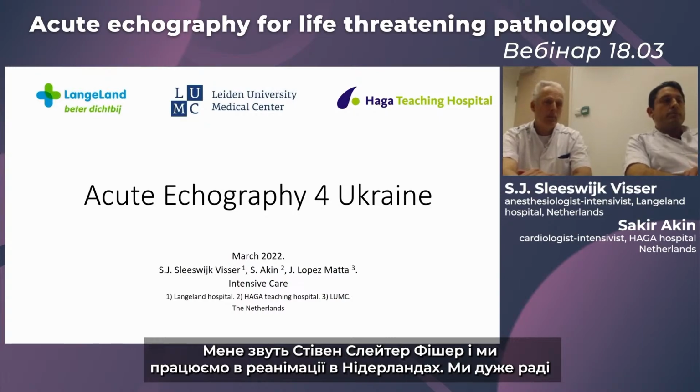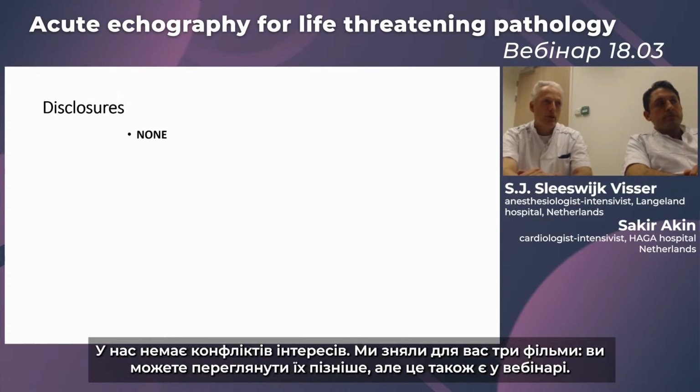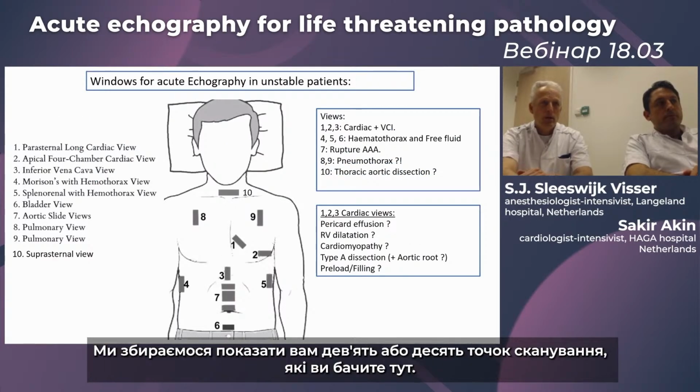We are very happy to make this webinar for you about acute echography, and we hope it will help you in your daily practice. We have no disclosures. We have made 3 movies for you, and you can look them up later, but it's also on the webinar. We are going to show you 9 or 10 windows.